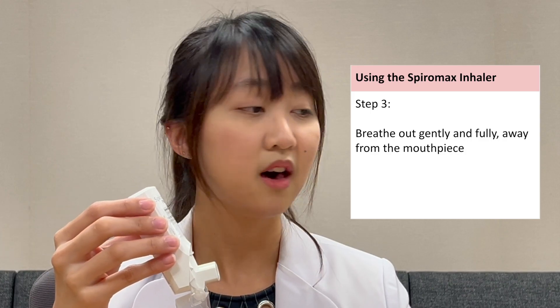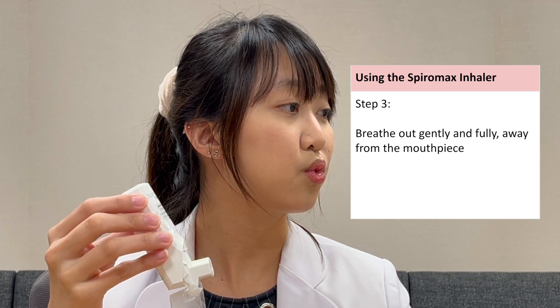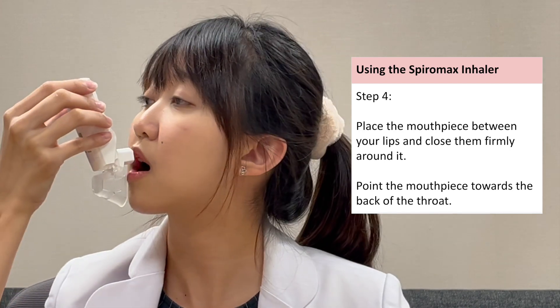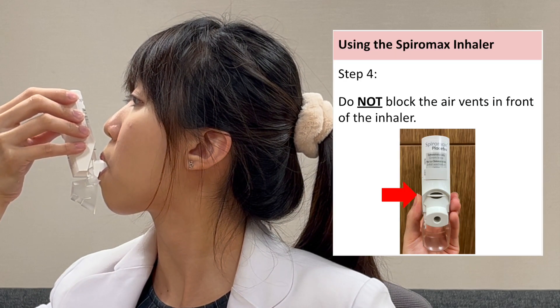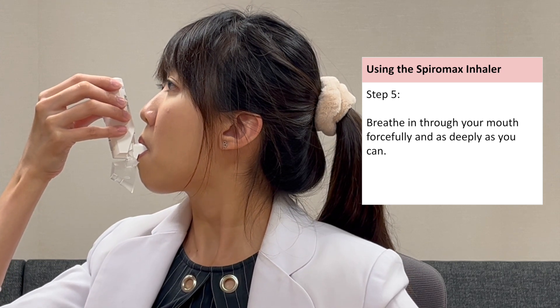Breathe out gently and fully away from the mouthpiece. Place the mouthpiece between your lips and close them firmly around it. Point the mouthpiece towards the back of your throat. Do not block the air vents in front of the inhaler. Breathe in through your mouth forcefully and as deeply as you can.